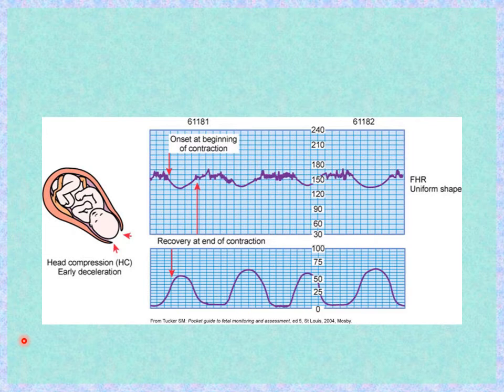These are considered benign and therefore intervention is not wanted. If you look at these decelerations, they go down and back up with the contraction. They look very similar to the contractions and look like a mirror image.